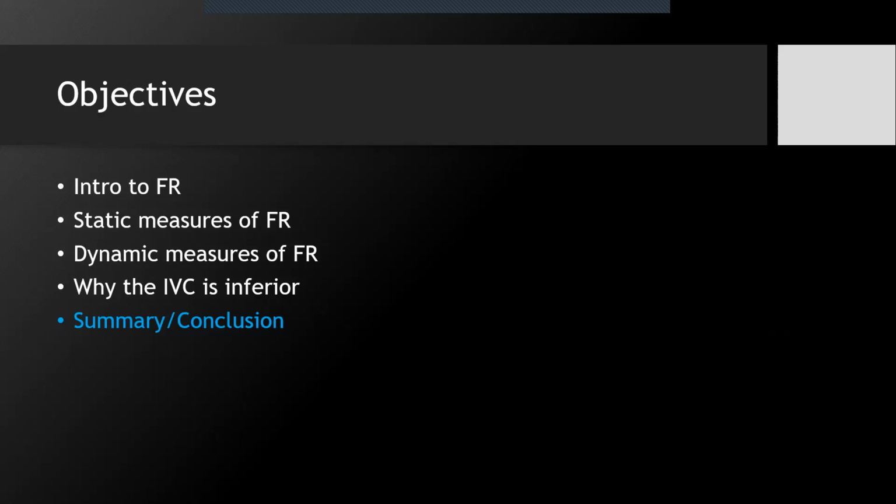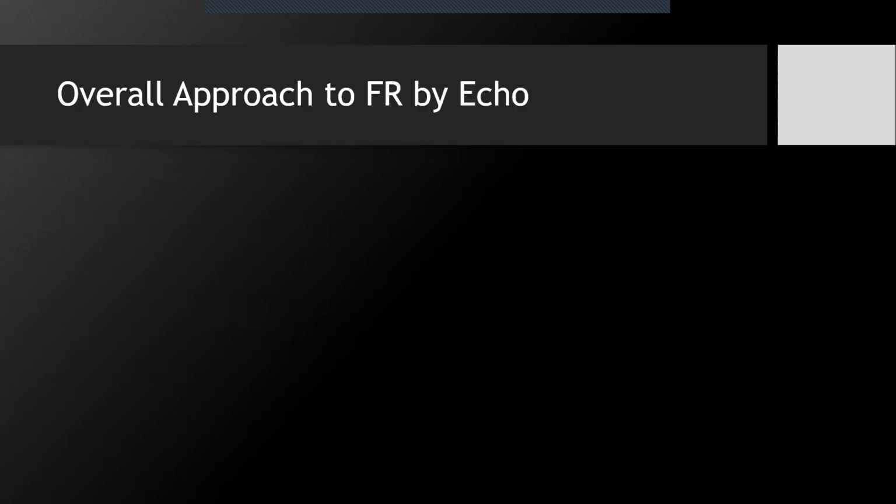So in sum, to wrap this all up, the overall approach to fluid responsiveness by echo is: you first have to ask the question of, is there impaired tissue perfusion, right?